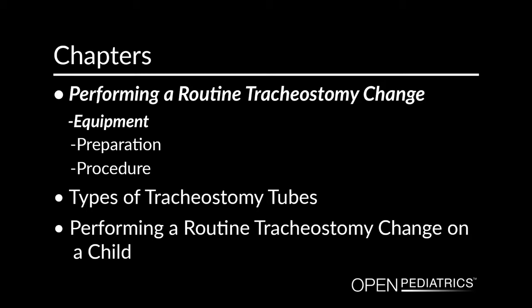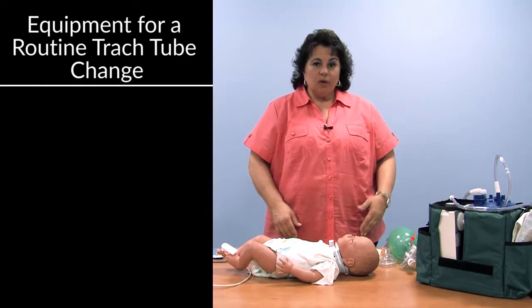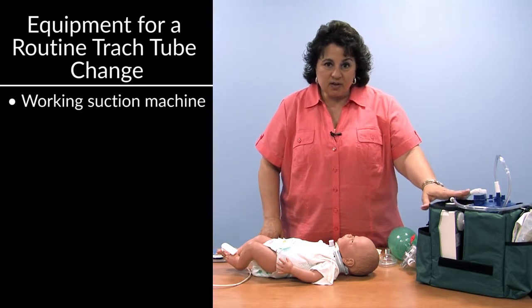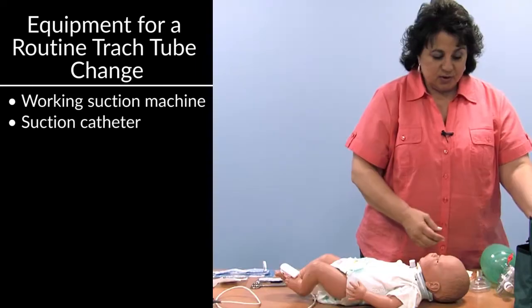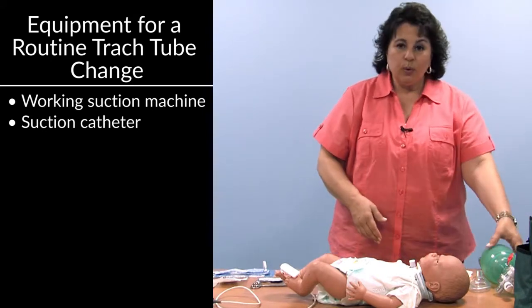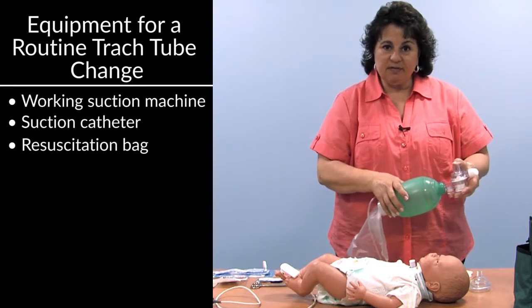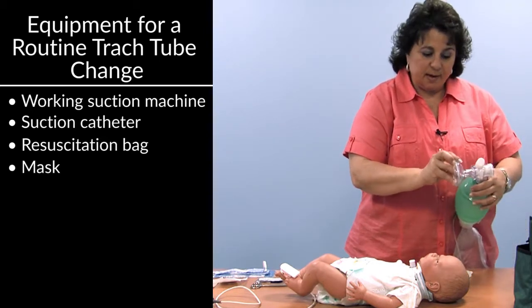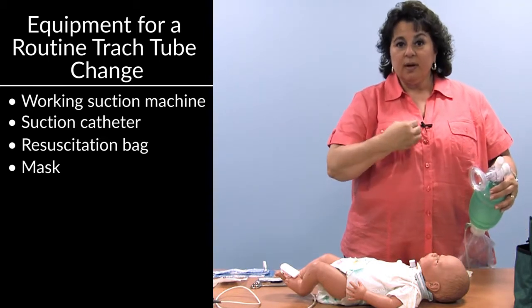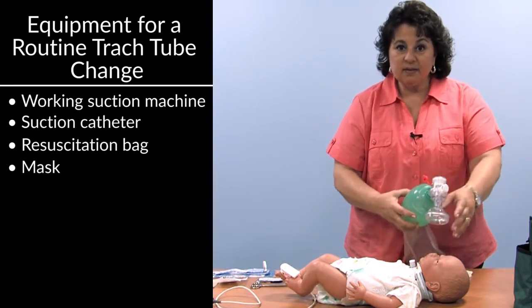Performing a routine tracheostomy change. Equipment. We're going to gather some items. We're going to assure that we have a properly working suction machine and that we have a properly sized catheter to suction the tracheostomy tube that's in the child. We want to have a resuscitation bag with pop-off that is properly functioning for us. We want to have a mask that can fit onto that bag in the event that the tracheostomy tube is out, we cannot get it back in. We want to provide the child with bag mask ventilation.